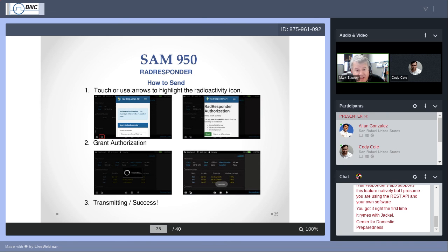And again, you will get a transmitting sign. Sometimes there'll be a dark square in the center of the screen that lasts maybe 5 or 10 seconds. Don't be alarmed. It's something I've seen that's pretty much normal, I guess, now. But eventually you should see success. And you've now sent a testing and training event report to the location where your company keeps your folders, and you've stored that event there, and that part is successful. That said, always the caveat.